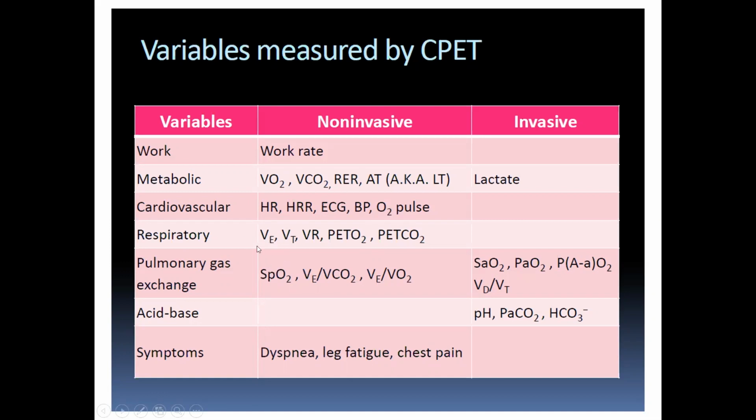In the respiratory, I told you VE means total ventilation, minute ventilation. VT means tidal volume, how much you're inhaling with each breath. VR is called ventilatory reserve. That is a very important thing that we have to look at. End-tidal O2 and end-tidal CO2.